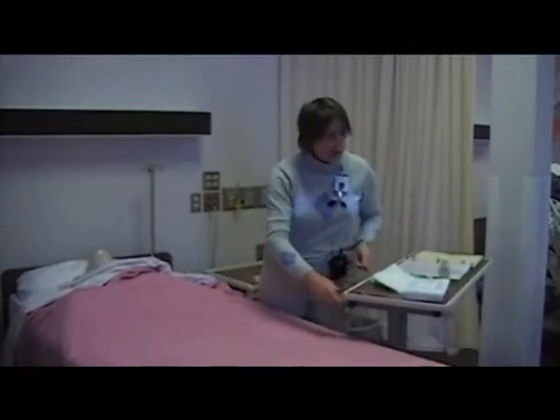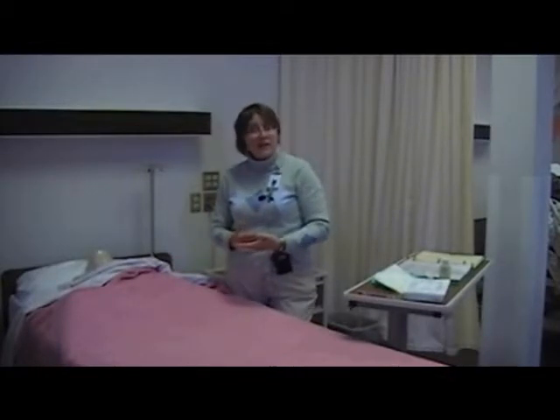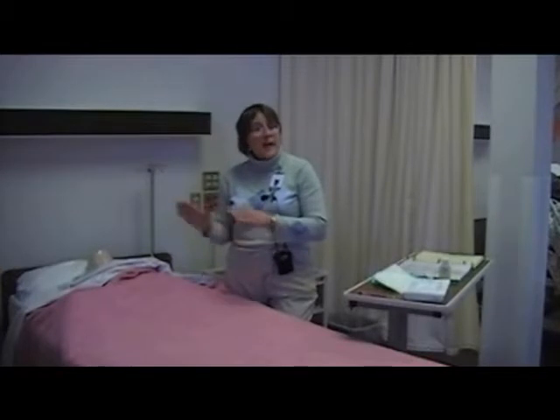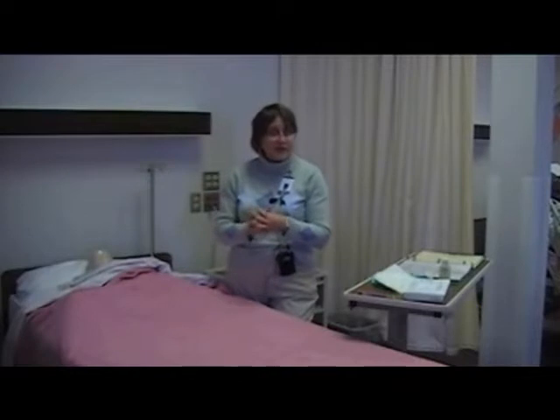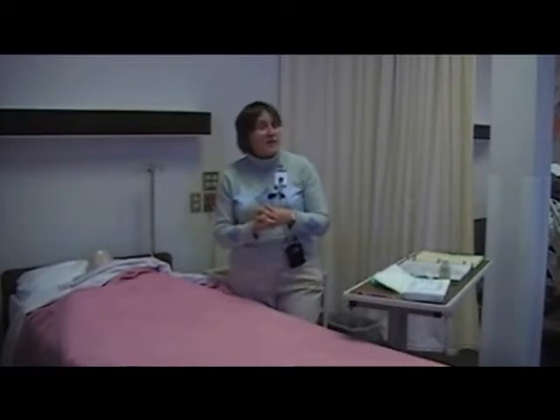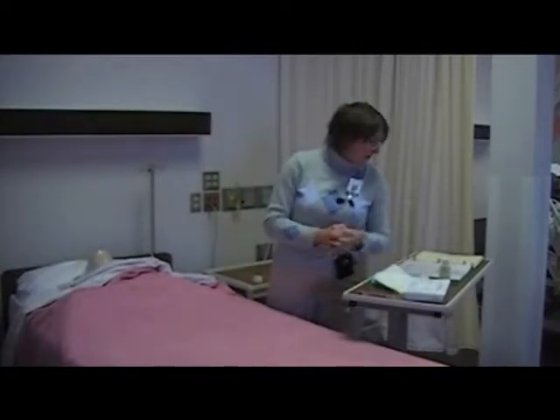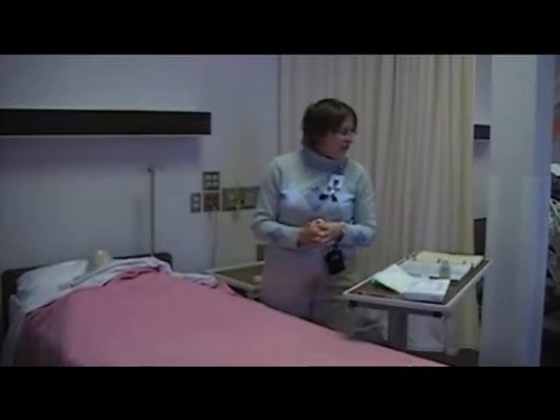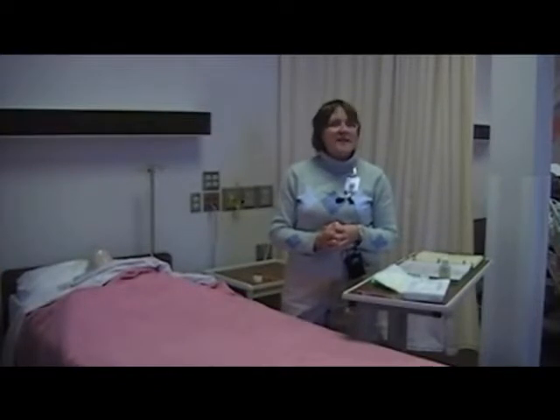Now, when you do this dressing change, it is a sterile procedure. Think back to what we just discussed about where this IV ends. It ends in the superior vena cava usually. If I were to have an infected site, or if I were to contaminate something during my procedure, my patient's going to get an infection, catheter-related bloodstream infection, and the fatality rate on those is too high. There is research that shows that every infection that's caused from the catheter-related bloodstream infection adds between $35,000 and $50,000 per hospital stay, plus an additional 7 days in the hospital.